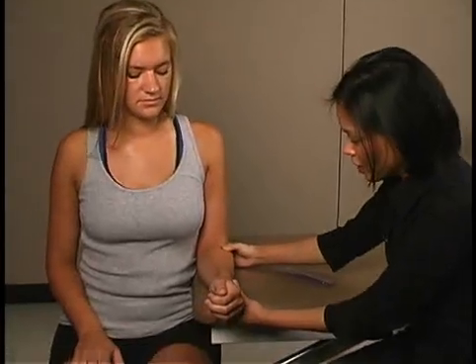Ms. Reese, I'm going to measure how much you can move your forearm using this device. When I ask you to, I want you to move your palm facing down this way and hold it there.